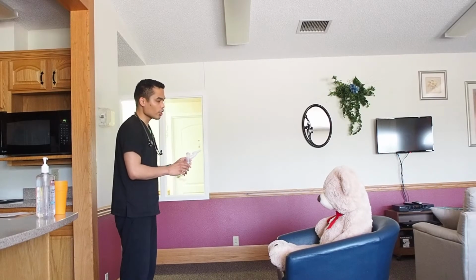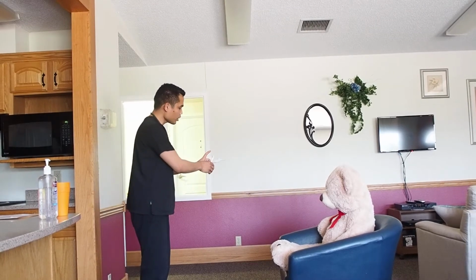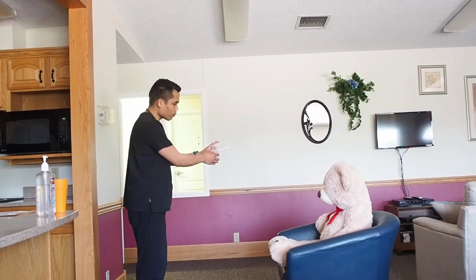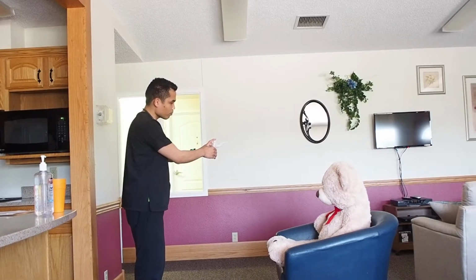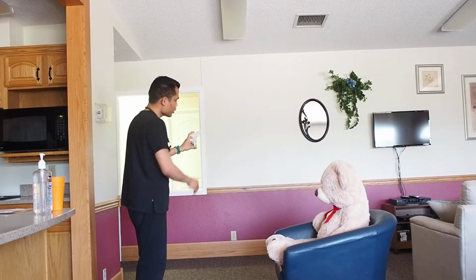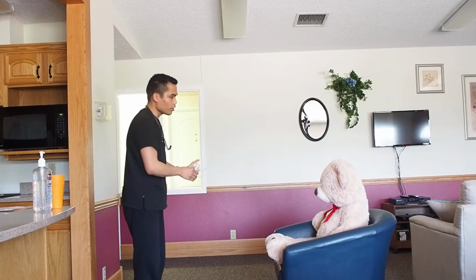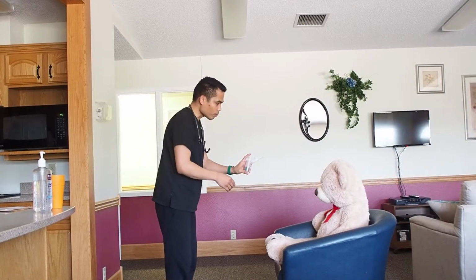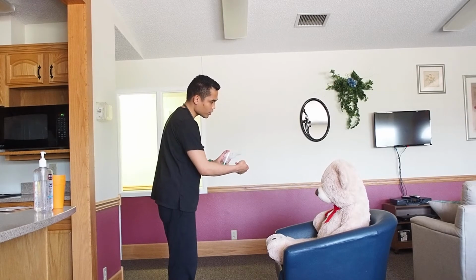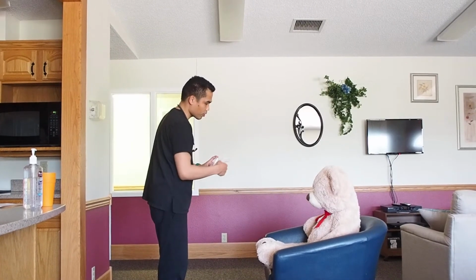So first, you have to exhale all your air out away from the device, and then you position your hand, especially the index finger on the top, to help actuate or press the device, and your thumb below. And then shake the device, and after shaking, actuate or press away from you. Okay, like that. And then position this inside your mouth with your lips sealed, and your tongue should be below. Please do not obstruct the mouth, please.